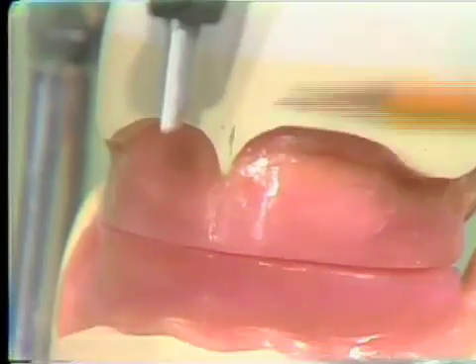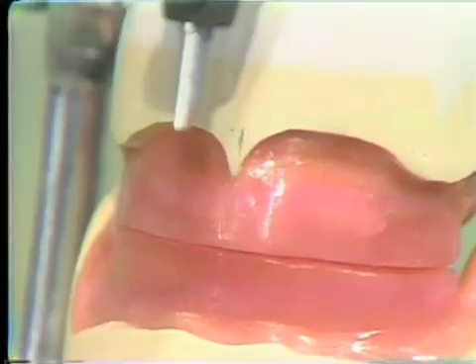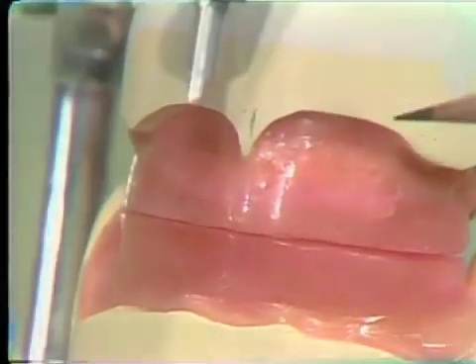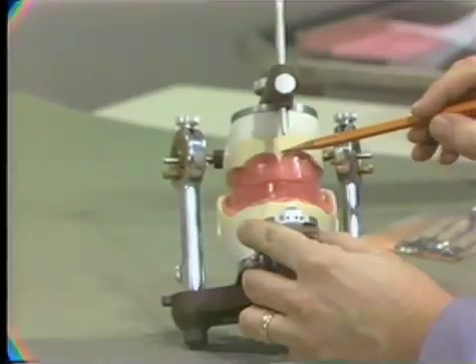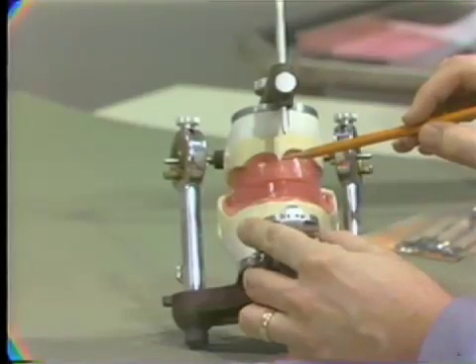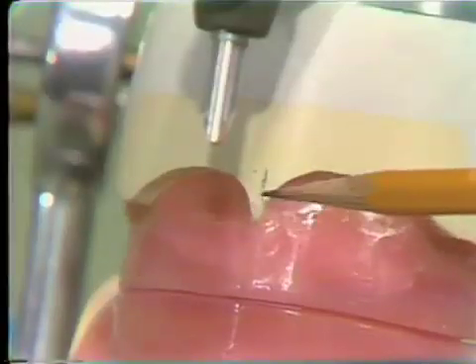Now, sometimes there are people who will use the papilla, for instance, as a guide to the midline, or the frenulum. But this isn't always a good guide. As you can see in this case, I've just made a small line. I haven't lined it up yet perfectly, but it looks like the midline is going to be a little bit to one side of the maxillary anterior frenum. And this is sometimes the case.